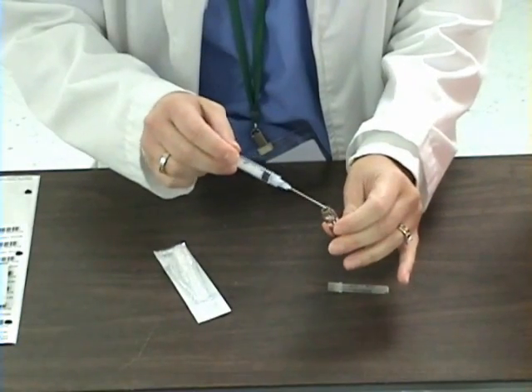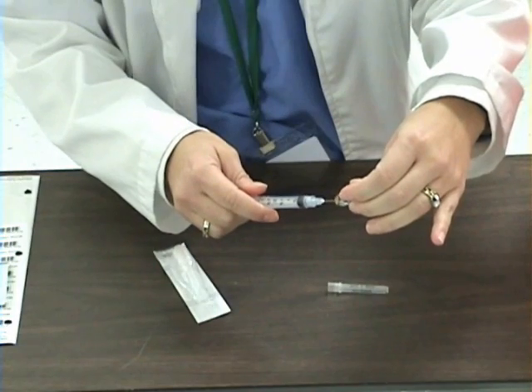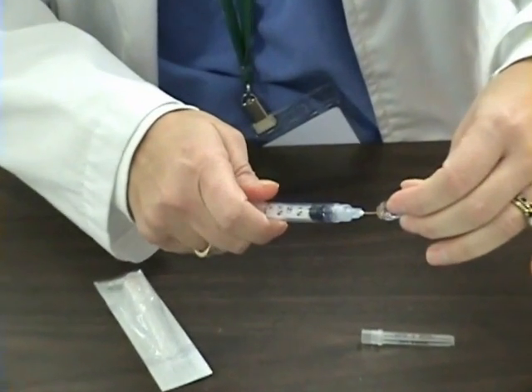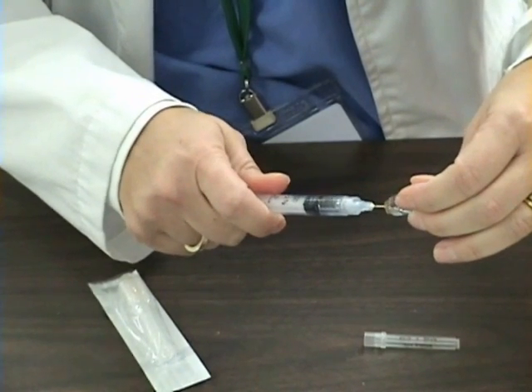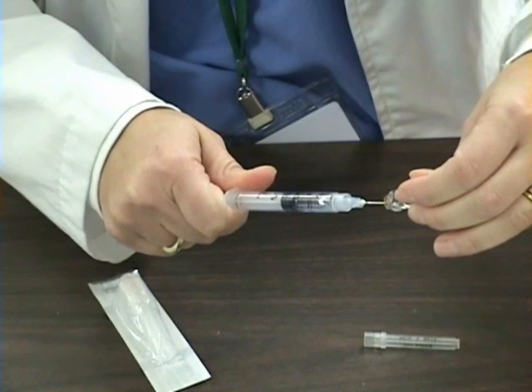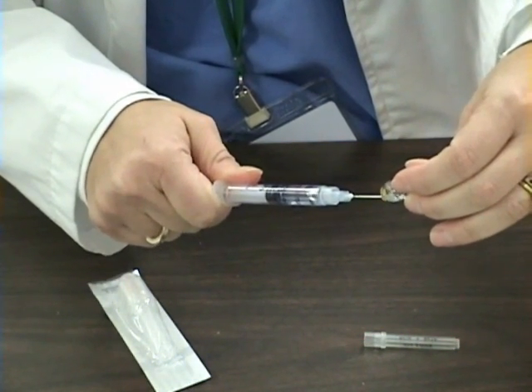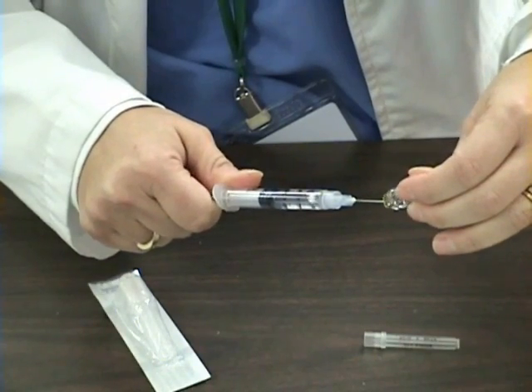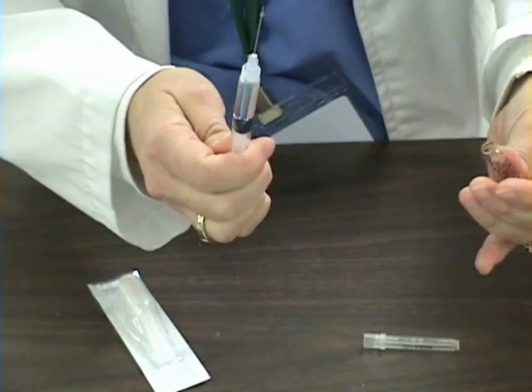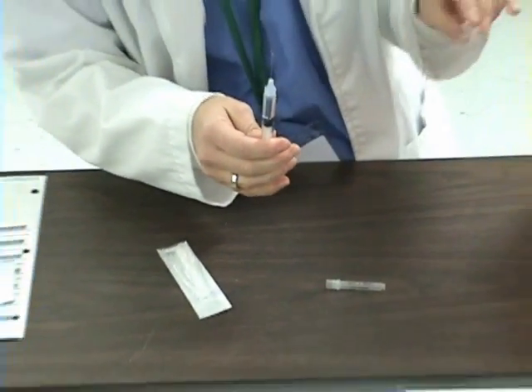I will put my needle in my medication, invert, and withdraw my medication. Noting that even when I invert my ampoule, the medication does not pour out of it. At this point, I am going to dispose of my ampoule in my sharps container.